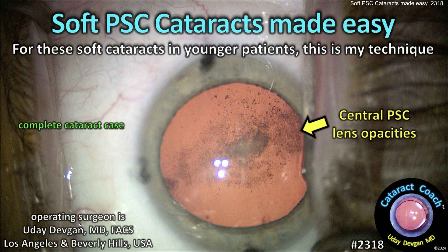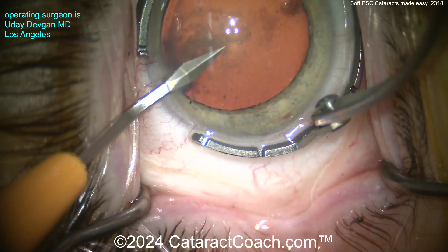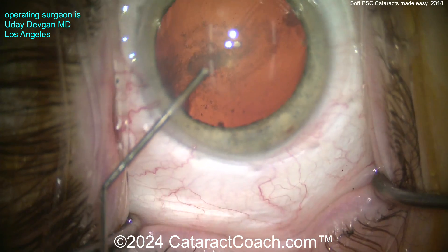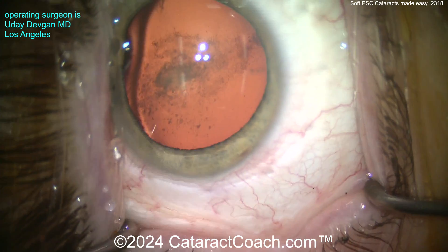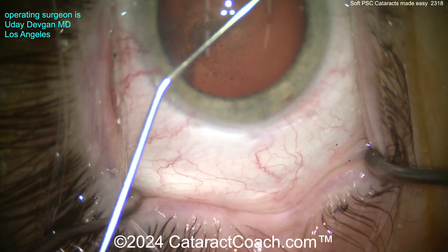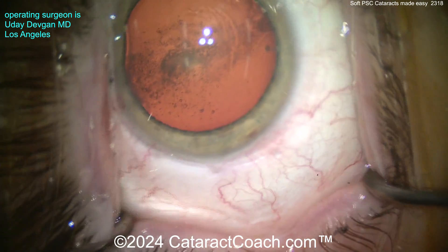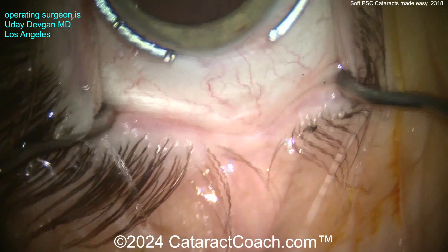Soft PSC cataracts made easy for soft cataracts in younger patients — this is my technique. This patient is pretty young, under age 50, and there's a very opaque central posterior subcapsular cataract. You can see the opacity right there in the center, causing a lot of difficulty with vision — diminished best corrected acuity and a lot of glare disability. Your traditional technique of divide and conquer, stop and chop, or even phaco chop is not going to be ideal here.